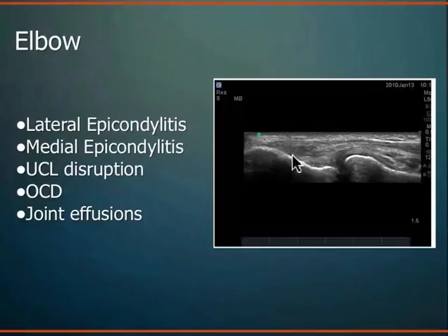So the tennis elbow is really a tendon disorder. And so the epicondylitis is a little bit of a misnomer, but what you're dealing mostly with is tendon pathology or tendon abnormalities. And so on tennis elbow, a lot of times you can visualize that tendon quite nicely. And this tendon has this fluid collection here, disruption of normal tendon fibular pattern. It's a little bit thicker. So this is a tendinopathy or probably a chronic tennis elbow. And you can see that quite nicely here. And again, you can direct injection treatments in other modalities, new modalities like platelet-rich plasma and some of these things you guys have probably heard about. And you can use the ultrasound guidance very well for that.